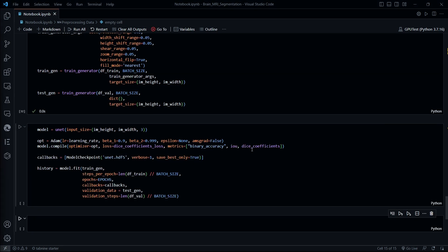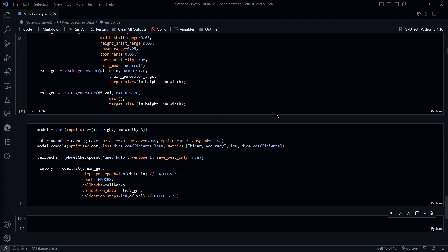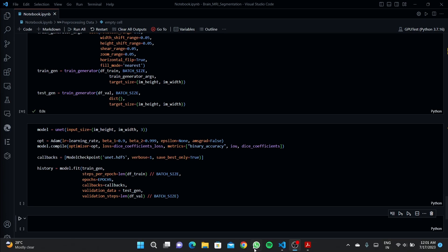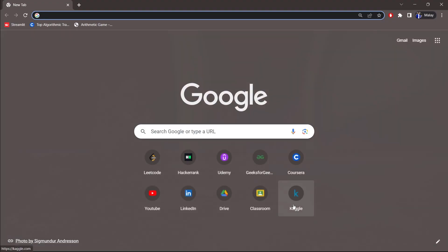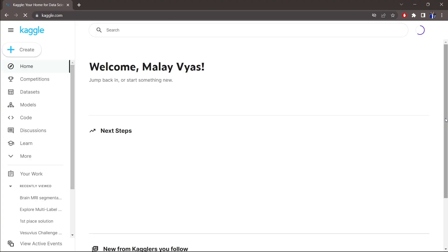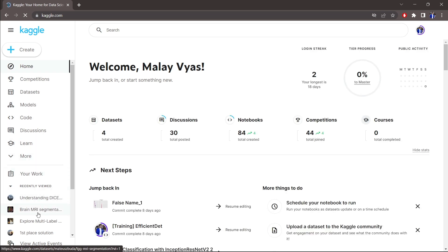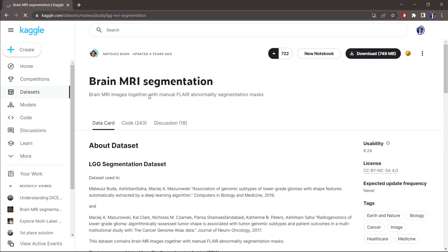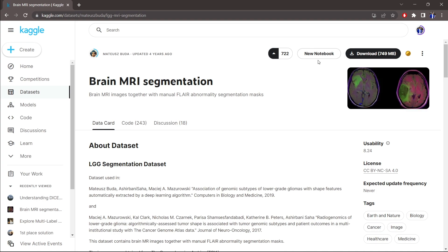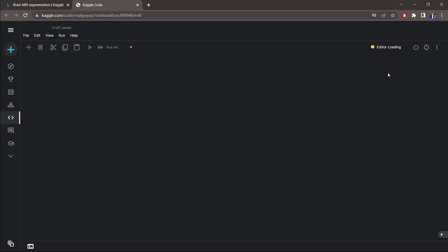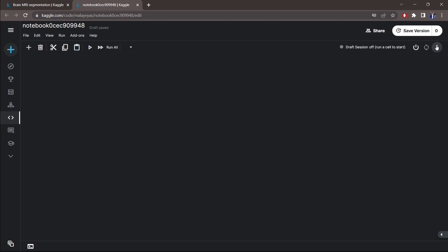So what we have done up till now is we have defined all these things. Now what I would suggest is to go to Kaggle. Go to brain MRI segmentation and create a new notebook, as you can see over here that a new notebook has been created.